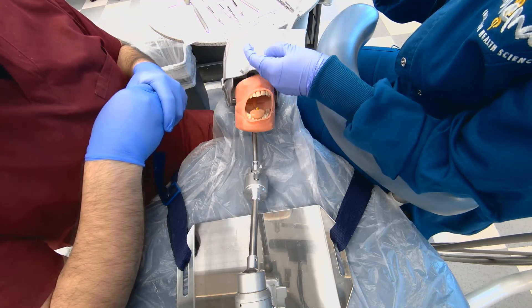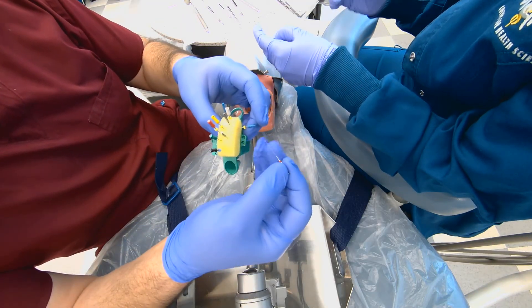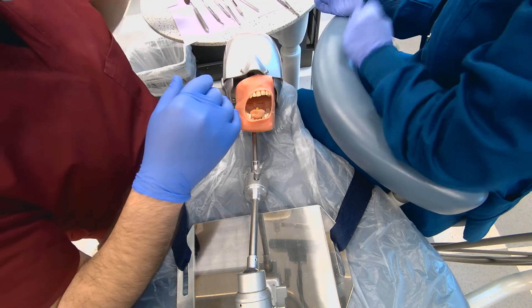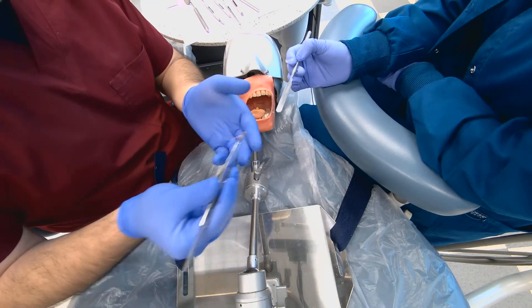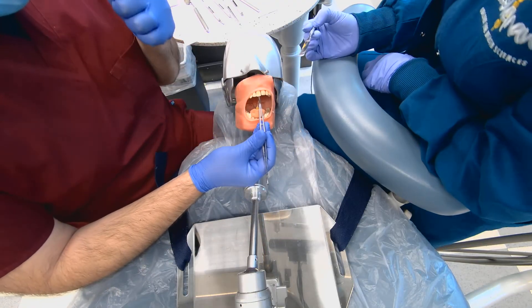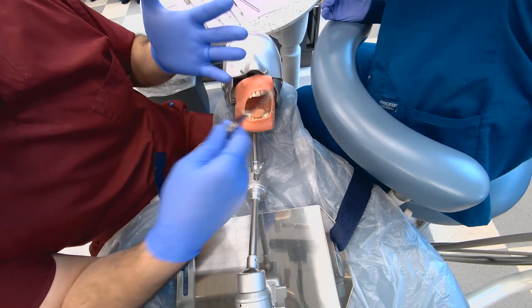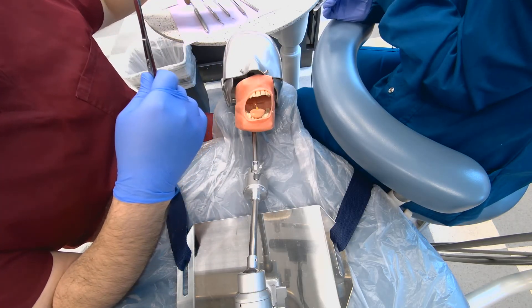We mix the sealer — we don't need a lot. The sealer can be placed in the canal using a lentulo spiral. Then we use the master cone that we already measured, place the sealer on it, and put it in. Based on the standard system we're using, we put the master cone in and then start placing accessory gutta-percha next to it by taking space with the spreader.